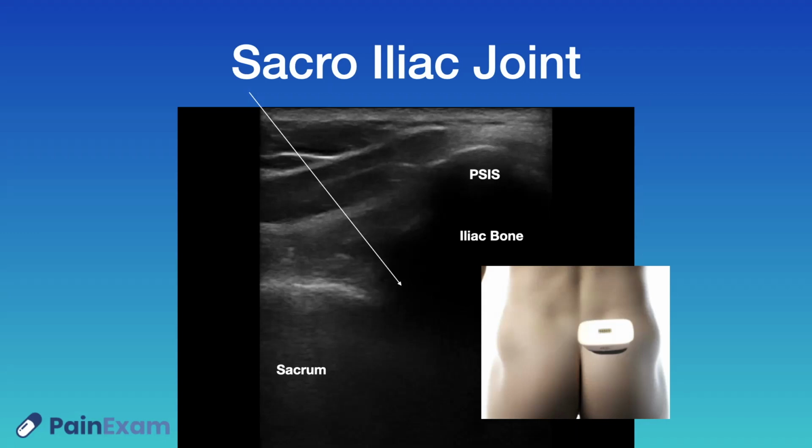As you slide more inferior to the inferior pole of the sacroiliac joint, as you would do under X-ray guidance, which most of us do it that way, the PSIS disappears and the bone comes right around to this level, so the joint space is not as profound. And I do think it is easier to get into the joint from the superior aspect with the ultrasound, unlike with the X-ray machine.